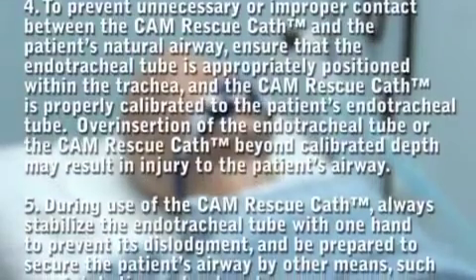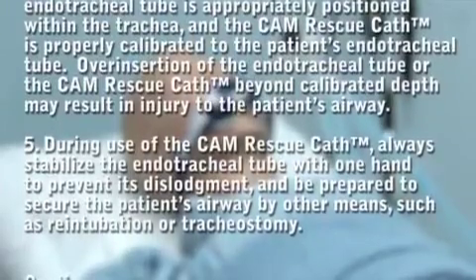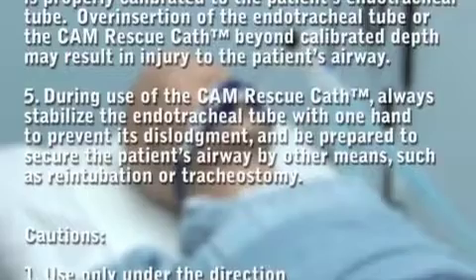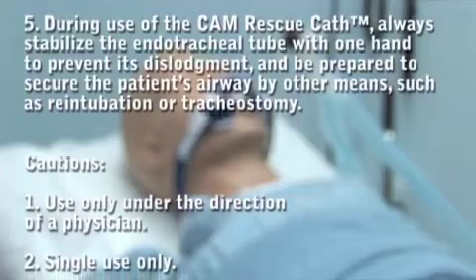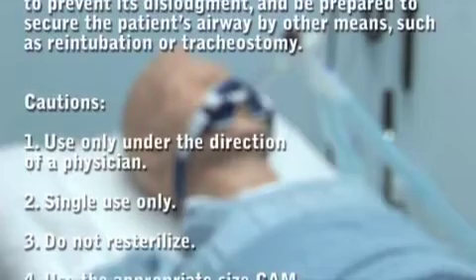To prevent unnecessary or improper contact between the CAM Rescue Cath and the patient's natural airway, ensure that the endotracheal tube is appropriately positioned within the trachea and the CAM Rescue Cath is properly calibrated to the patient's endotracheal tube. Over-insertion of the endotracheal tube or the CAM Rescue Cath beyond the calibrated depth may result in injury to the patient's airway.